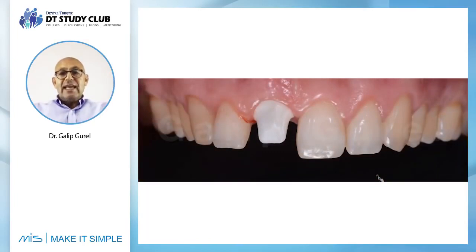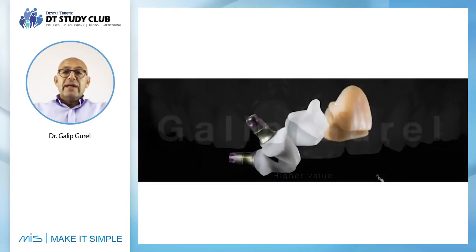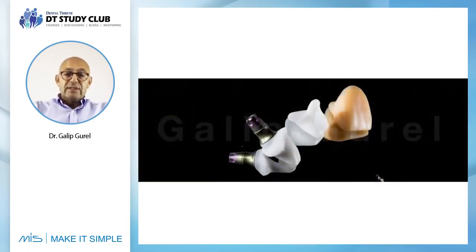And when it is a single tooth, either on a very darkly surfaced tooth surface or a very opaque abutment like this, trying to match it with the adjacent teeth is, I think, one of the hardest tasks that a technician can face. So again, we choose the highest value, and these are the parts that we're using. This is the abutment that we're using.